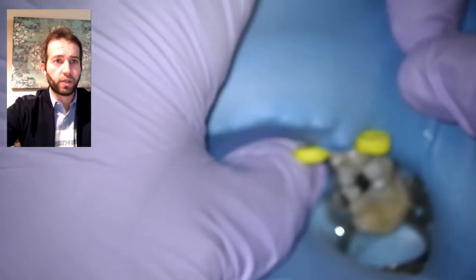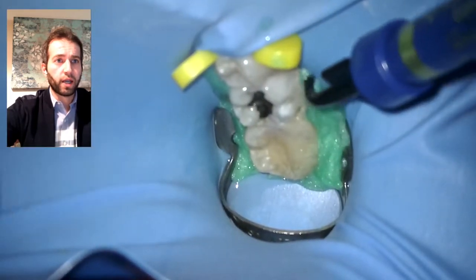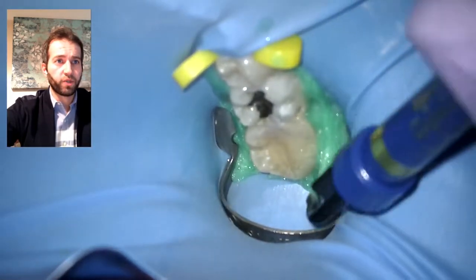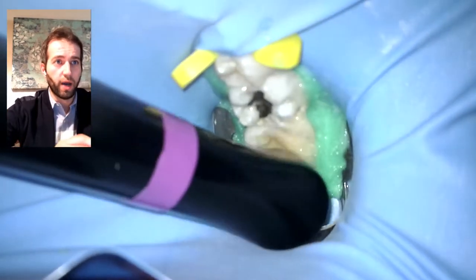Now I'm just placing the rubber dam, so this gives you a better picture of how I usually do it. Then secondary isolation with Opal Dam, just because there's still a splint, so you cannot do a single-tooth isolation — I'm isolating the three teeth that are splinted.